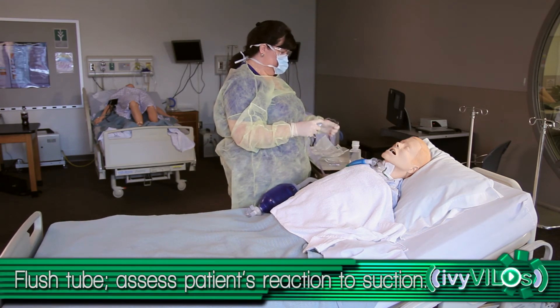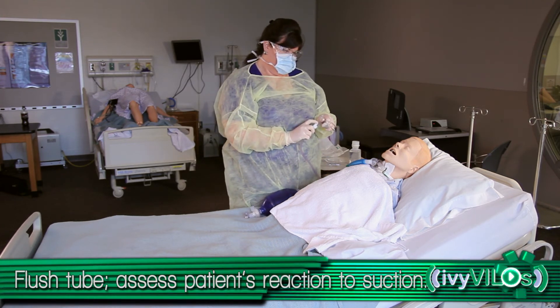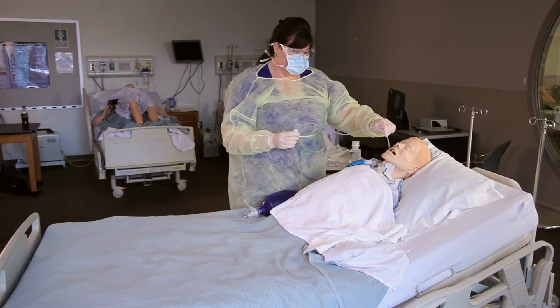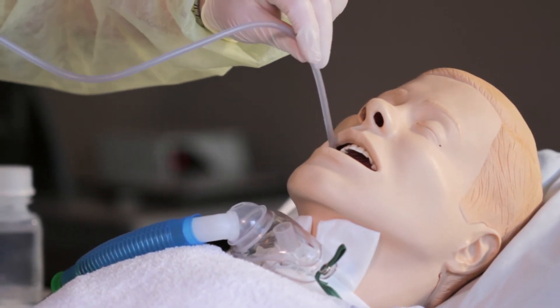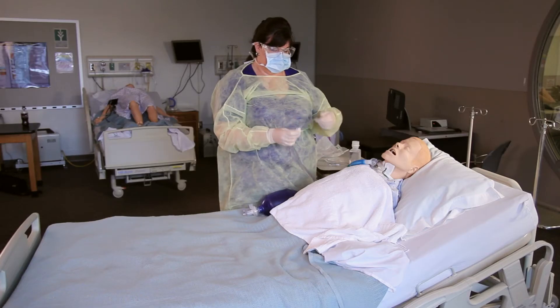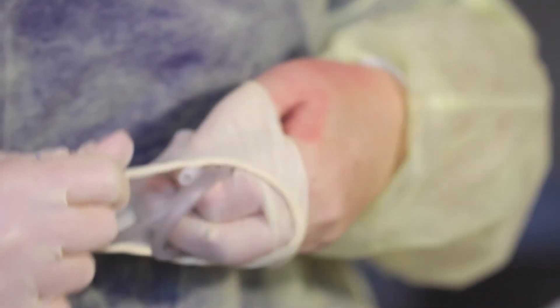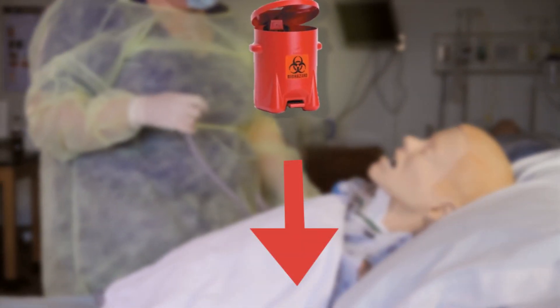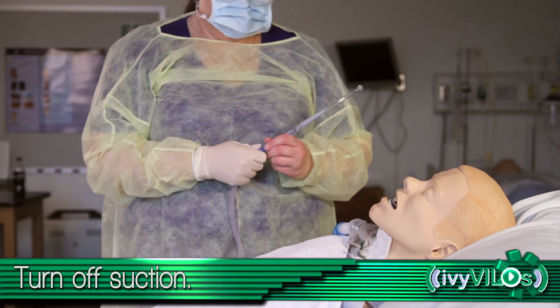Assess the effectiveness of suctioning on the patient. Suction the oral pharynx. When suctioning is complete, wrap catheter around dominant hand. Unplug catheter from suction tubing. Remove glove inside out with dominant hand along with coiled catheter. Discard into appropriate receptacle.